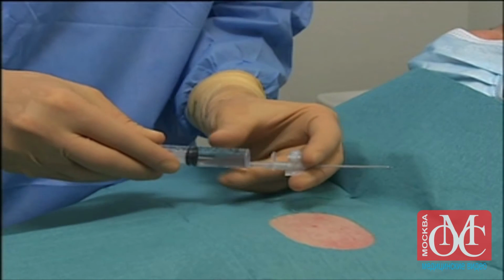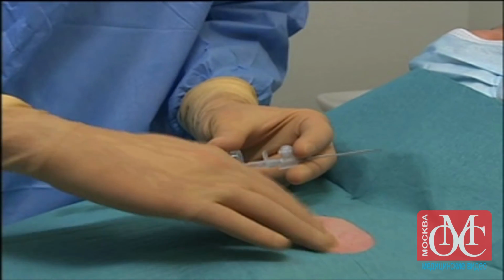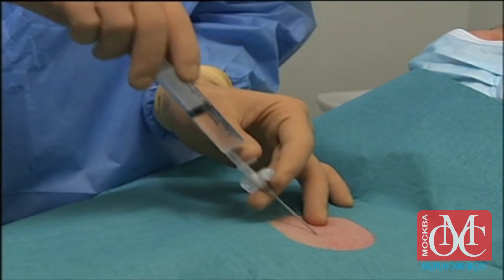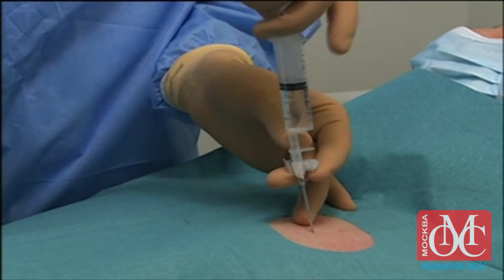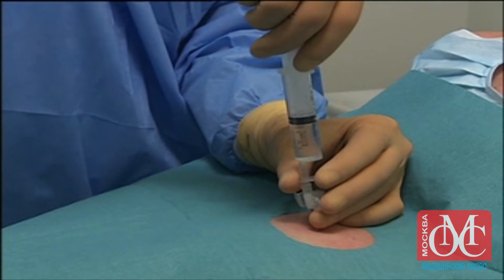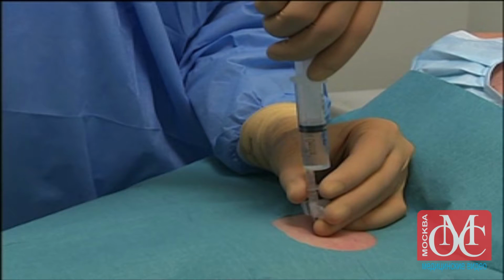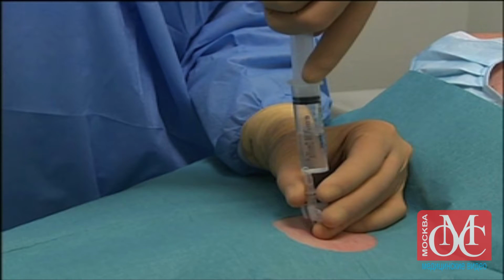Connect the over-the-needle catheter to the 10 milliliter lidocaine syringe, which should be partially filled with the remainder of the local anesthetic. Stabilize the skin with the non-dominant hand and puncture the skin with the catheter using the same landmarks that you used for the local anesthetic. Continue to aspirate with the syringe, slowly progressing in the direction of the pleural space. Again, when the needle penetrates the pleural space, air bubbles will appear in the syringe.